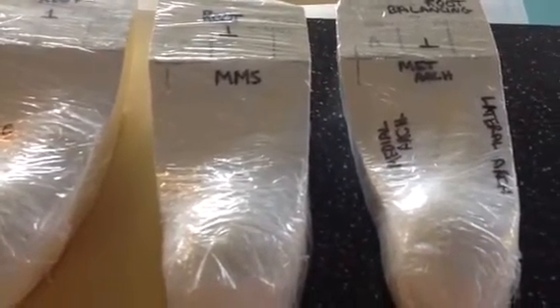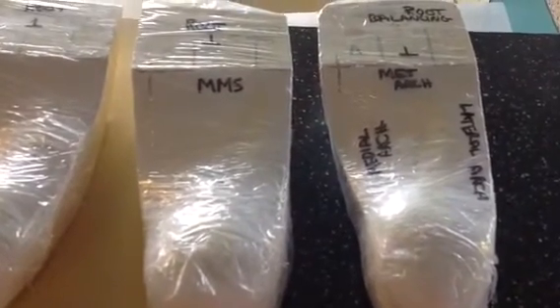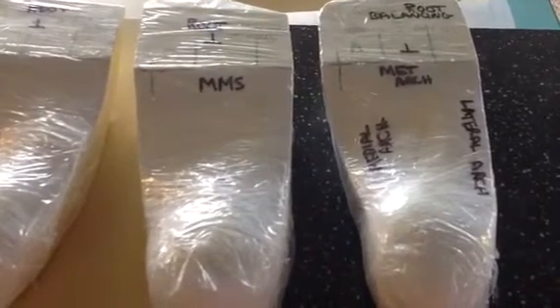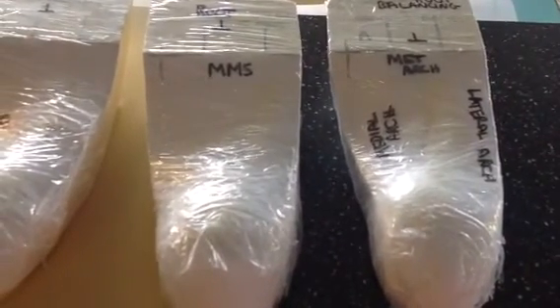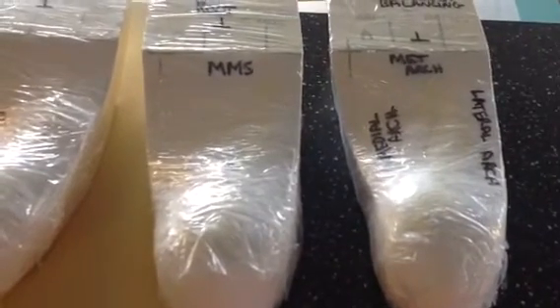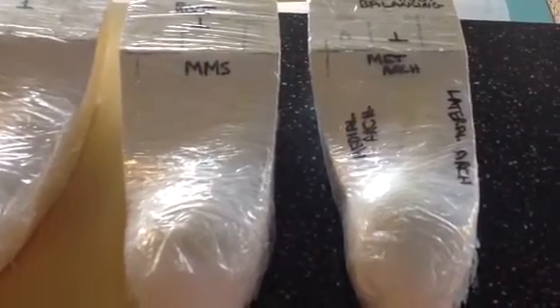The first modification is what we call maximum metatarsal support, the MMS support. I took the same correction of a root balance technique and just added more metatarsal support for a forefoot problem like a Morton's neuroma, a bunion, or a hammer toe situation. This is a very common modification that I use on the orthotic device.